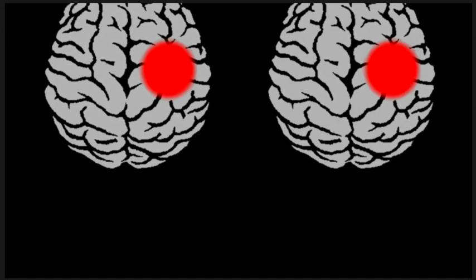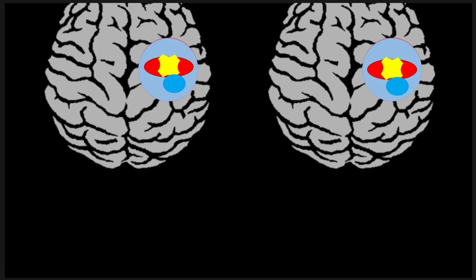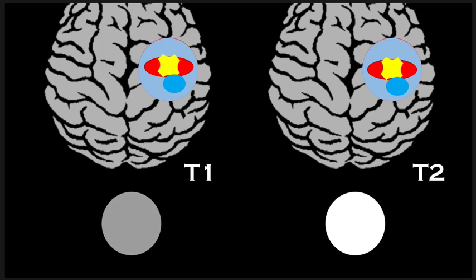So let's do a quick rapid review here. We've got our hematoma, and we've got our hemoglobin in its oxygenated state. And because of that, it's basically the same as other biologic tissues. It's weakly diamagnetic. So we're going to think about it as basically just the plasma, just the water. So that's going to be T2 bright, and then slightly iso to slightly dark on the T1 end.